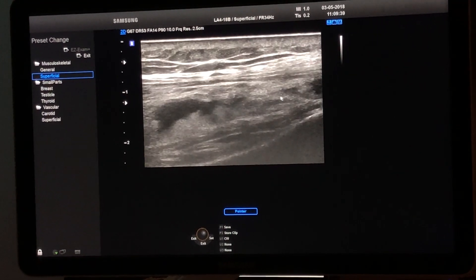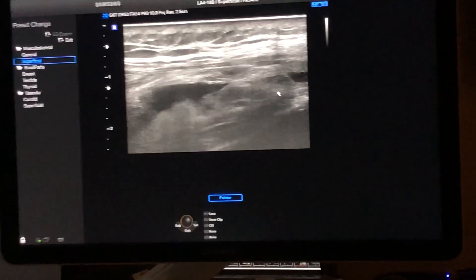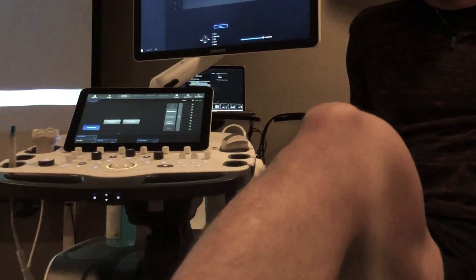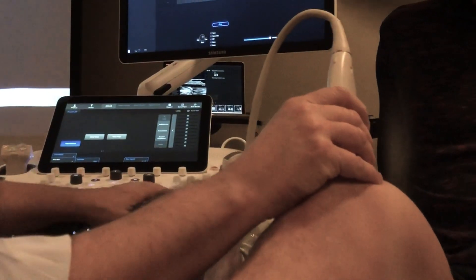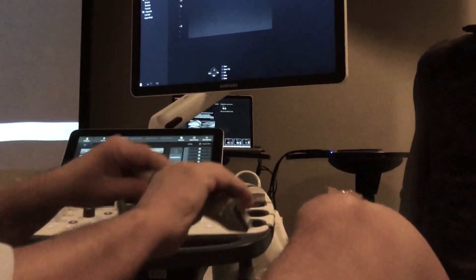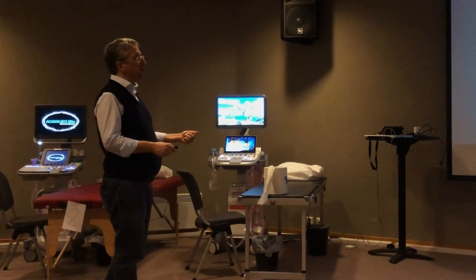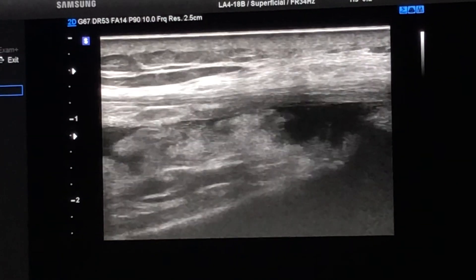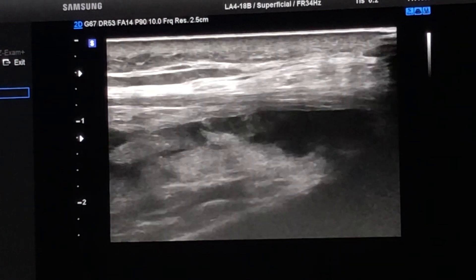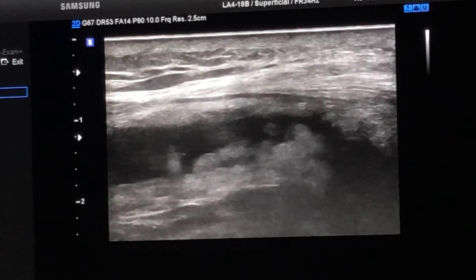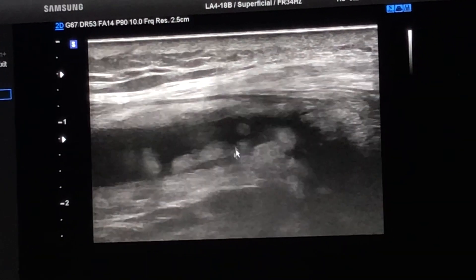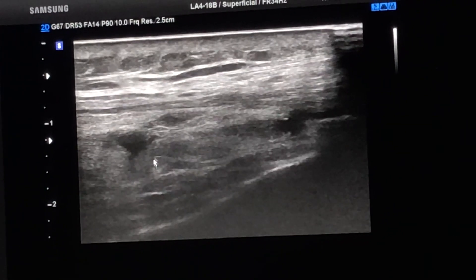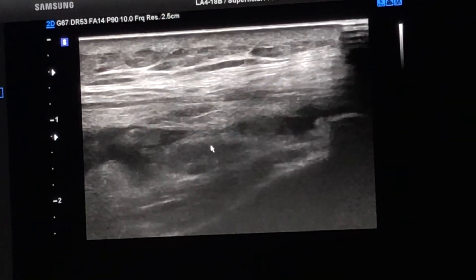This is the fat protruding within the recess we saw before. But what is that — synovium? Are you sure? The leaves of synovium look very hyperechogenic. Maybe synovium, but consider the differential diagnosis. Synovium is darker in general. This is the fat located on the lateral aspect of the suprapatellar bulging within the recess.